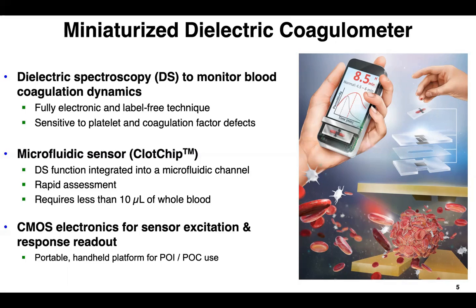And finally, because this technique is completely electrical, it can be interfaced with a CMOS IC for sensor excitation and response readout, and can be converted to a portable point-of-care platform.